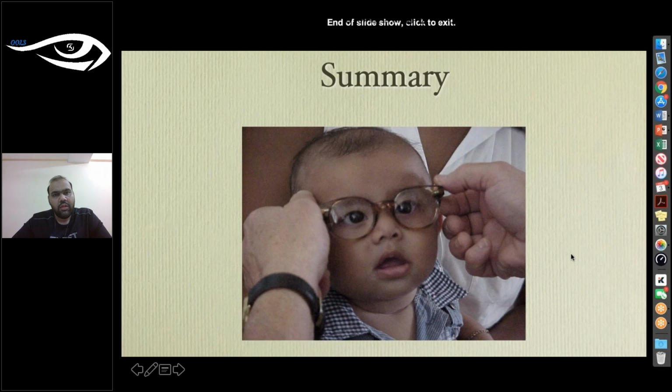In the first phase, we compared the Spot and those visual developmental questions in an early intervention population of 250 young children up to 3 years of age. We did a gold standard comprehensive cycloplegic eye examination and found that the visual developmental questions were as good or better than the refractive screening with the Spot at identifying kids with important vision problems.